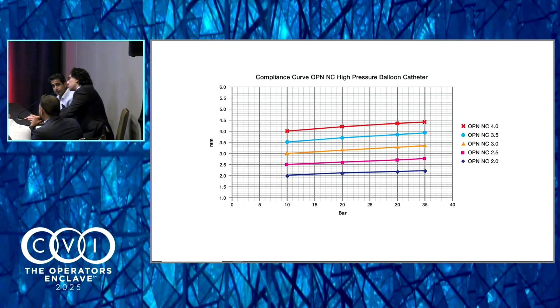I think the OPN balloon has been a great adjunct for me, highlighted by the second case. I should have mentioned it during the second case, the STEMI. There's a certain amount of fatigue that goes into these cases, doing rotational atherectomy or orbital atherectomy, like in that STEMI case I showed. You're trying to get the Impella on the left side, can't get it in. I find that the OPN balloon is safer, has fewer steps, and you get the same outcome as doing either rotational or orbital atherectomy. That's my take-home. It's been a game changer for me in that regard.